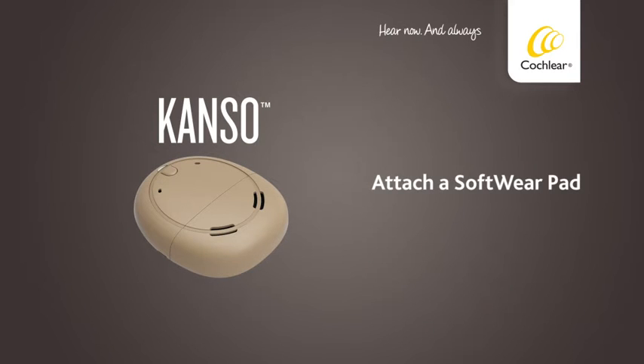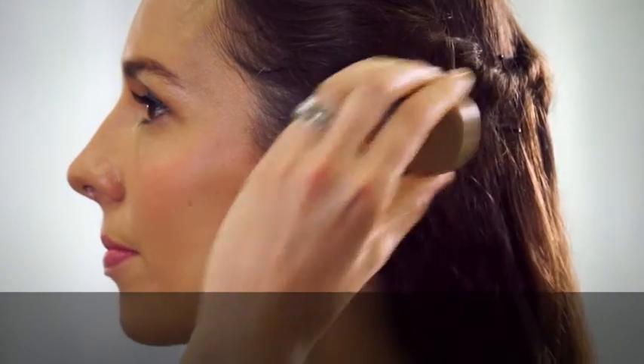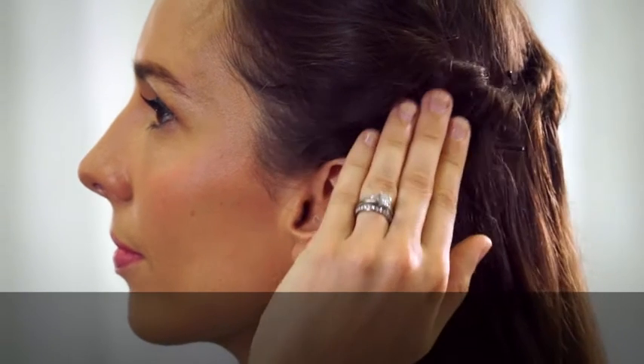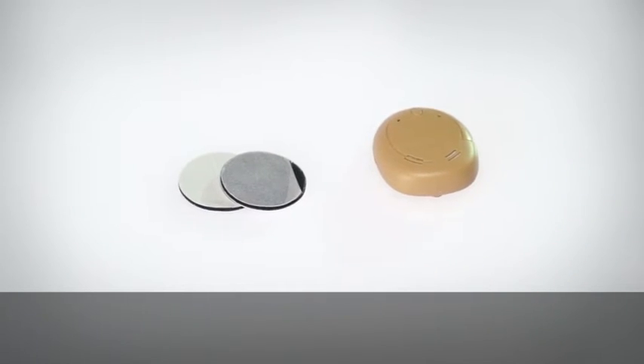Attach a SoftWear pad. If you experience discomfort when wearing your Kanso, you can attach the Cochlear SoftWear pad to the back of your processor.